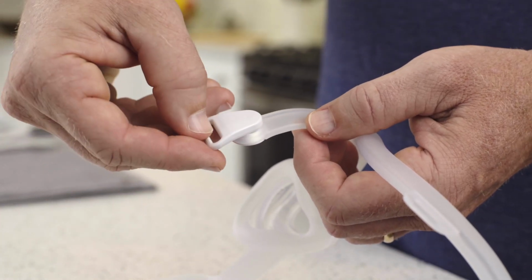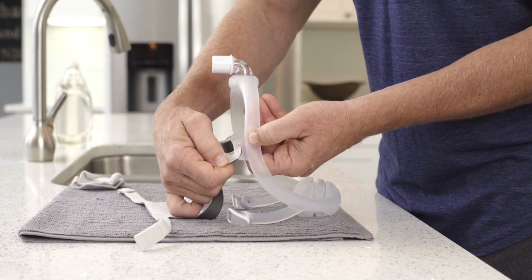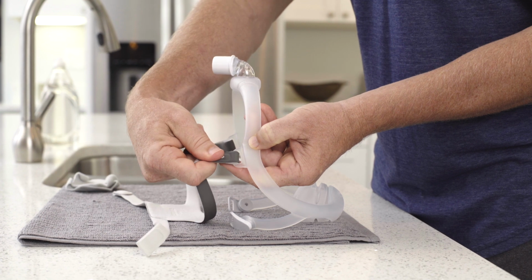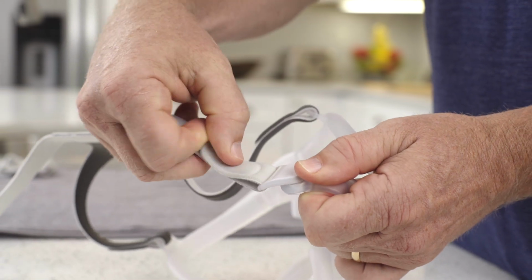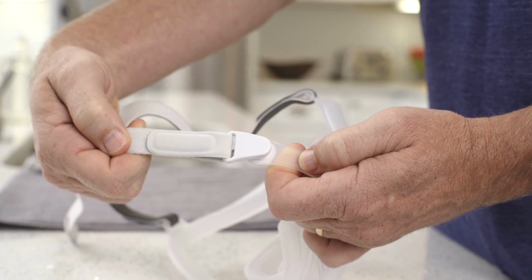Snap the front end of each magnetic clip to its circular receiving part. Now slide the tabs of the top strap into the slots at the top of the mask frame. Fold the tabs to secure them to the strap. Insert the tabs of the bottom strap into the slots on the magnetic clips. Once again, fold to attach.